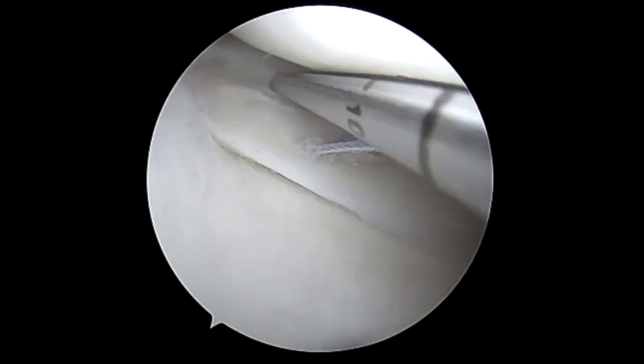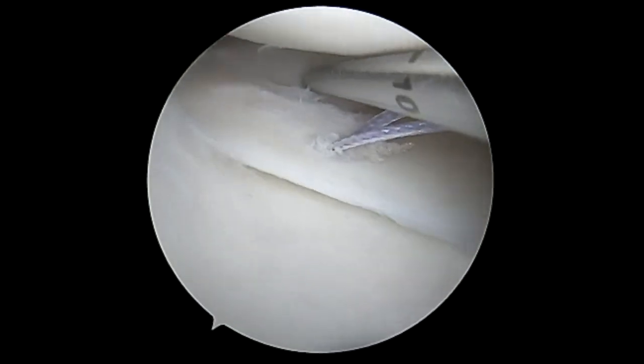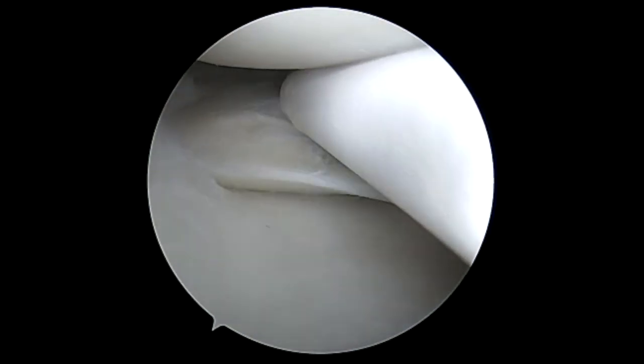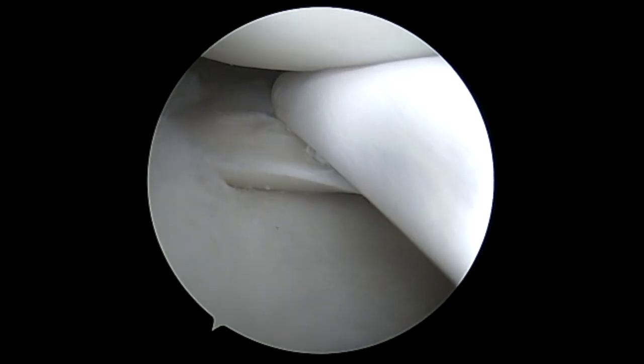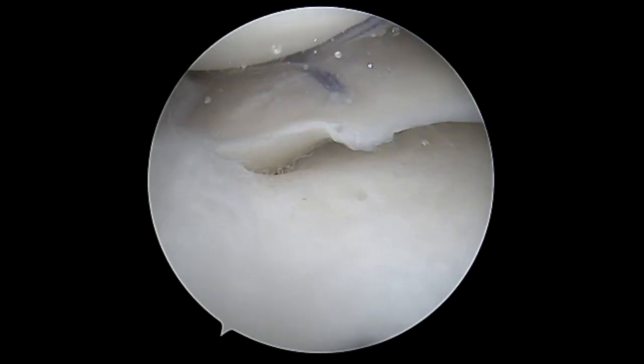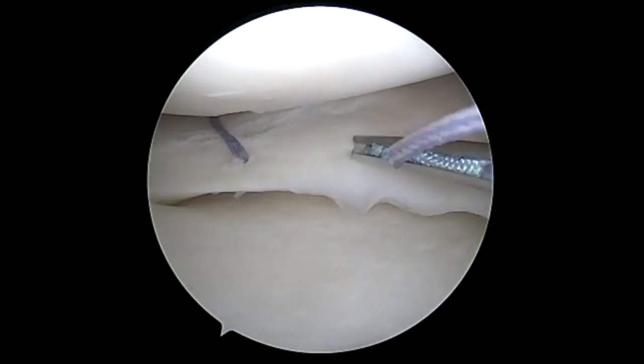Here we're going to do a vertical mattress. Given the size of the tear, the angle, and the small needle, you're able to get in the back and do a really nice vertical mattress using this newer device. Primary tensioning, then secondary tensioning — two strands of suture — and this really binds it well and compresses the tear back.